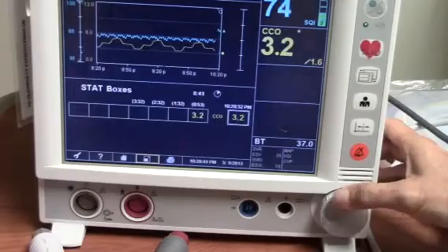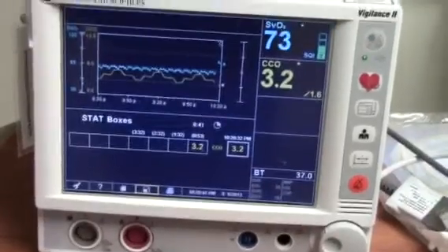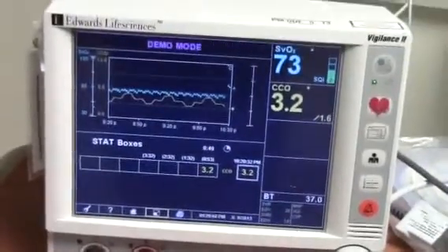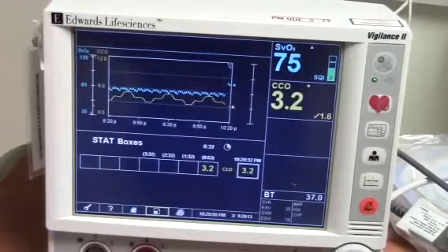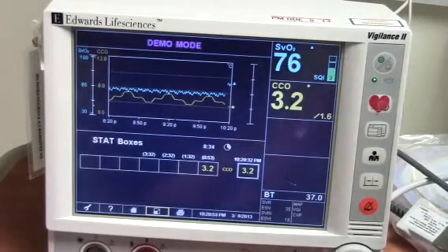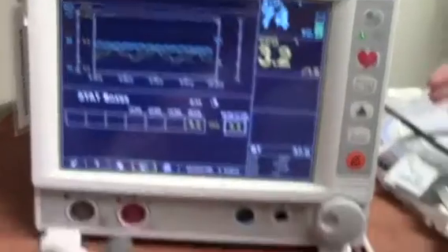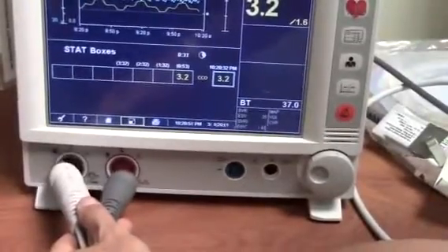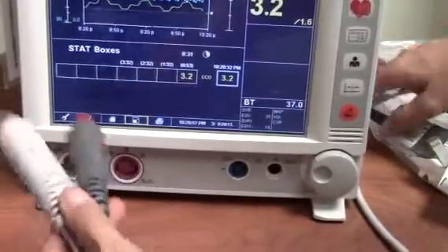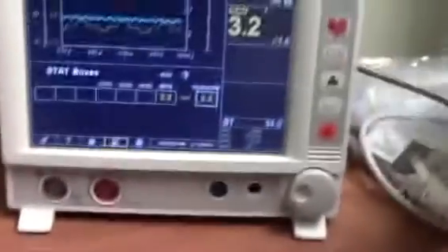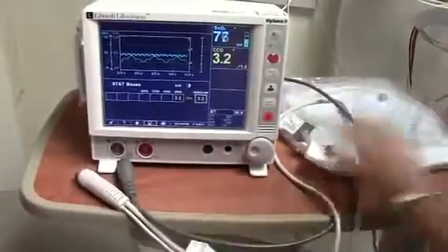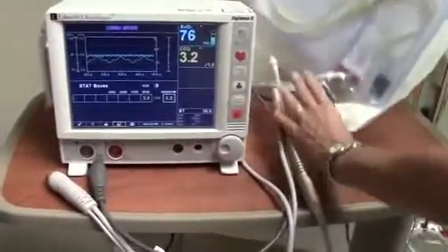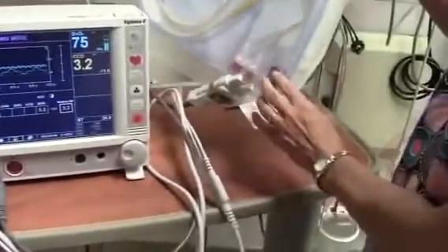Now let's see our data collected. Because the Vigilance 2 monitor does not operate on batteries, to transfer the patient to another department such as CT scan, disconnect the cables only. Please do not disconnect the catheter from the optical module, which is the blue disc on the catheter.